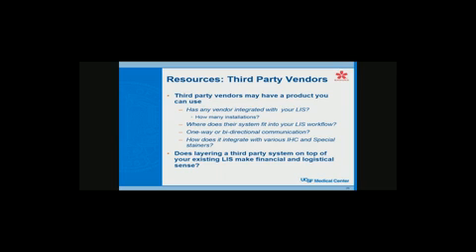If they have integrated with your LIS, how many installations have they done? Is it 1 or 2, or is it 50 or 100? Obviously, the more they've done, the more experienced they are with it, the more they know about it. Where does their system fit into your LIS workflow? This has to do with, where does the barcoding start? For instance, we found we had to install CoPath, CoPath ABT anyway, to work with a third-party vendor.